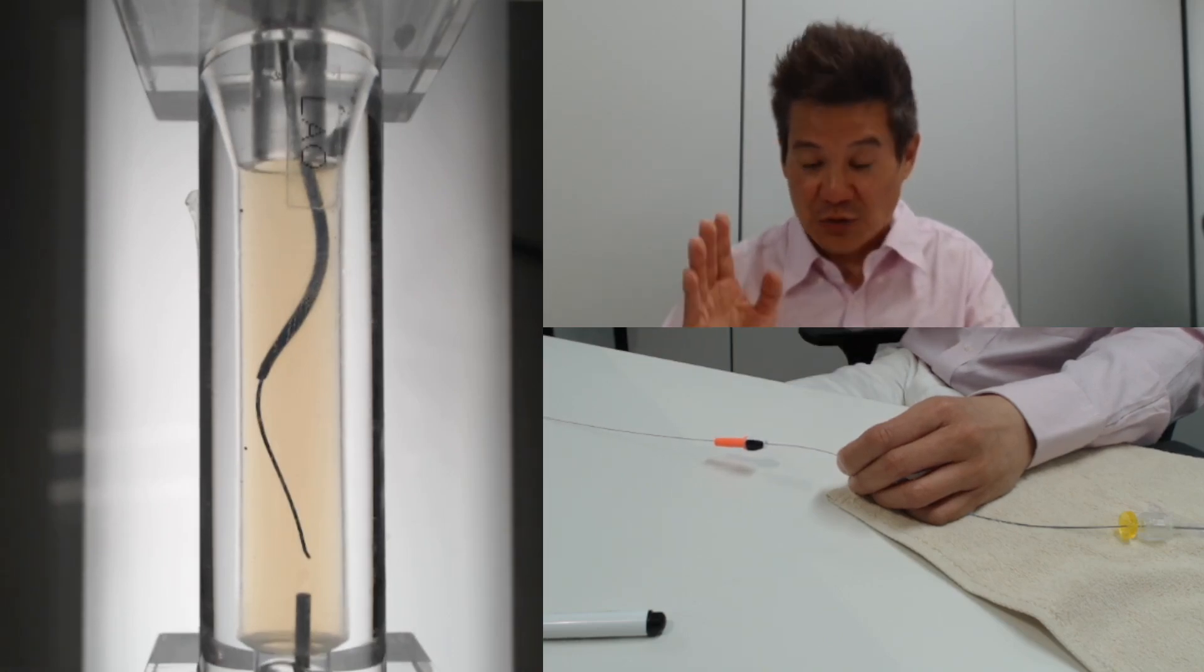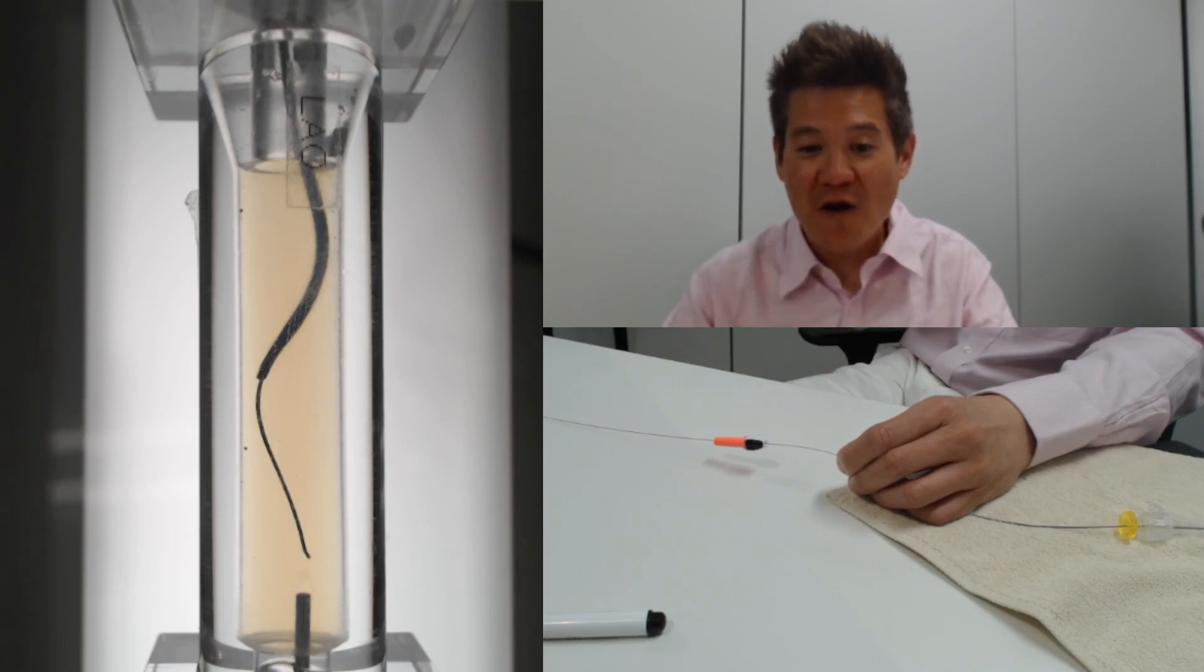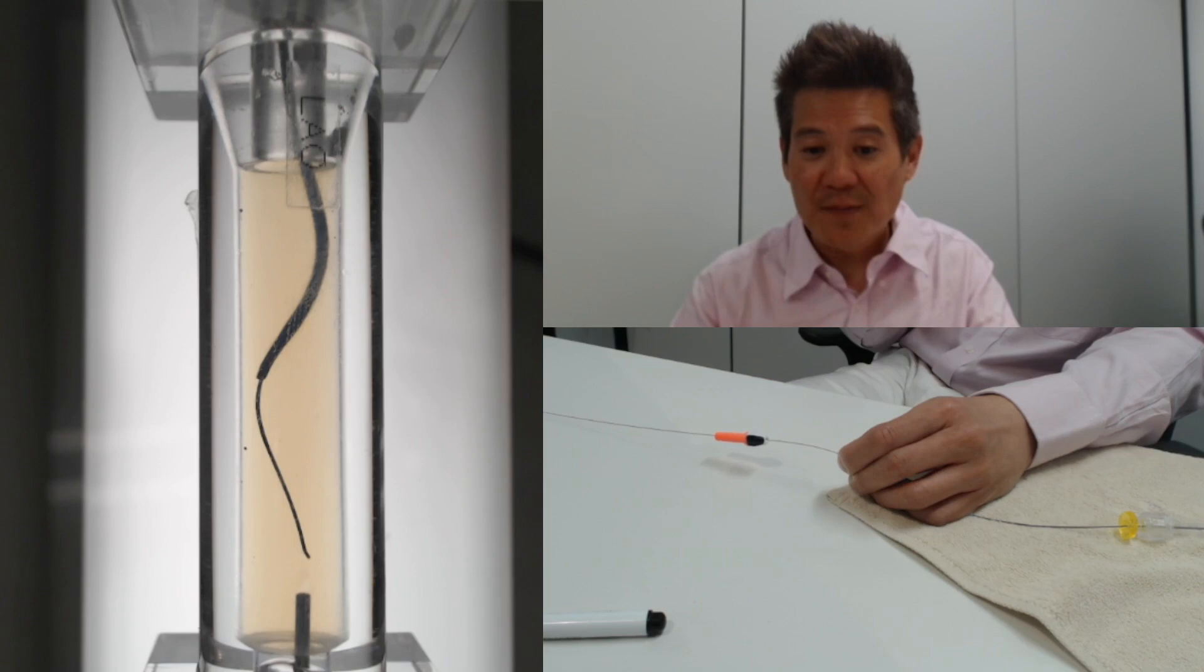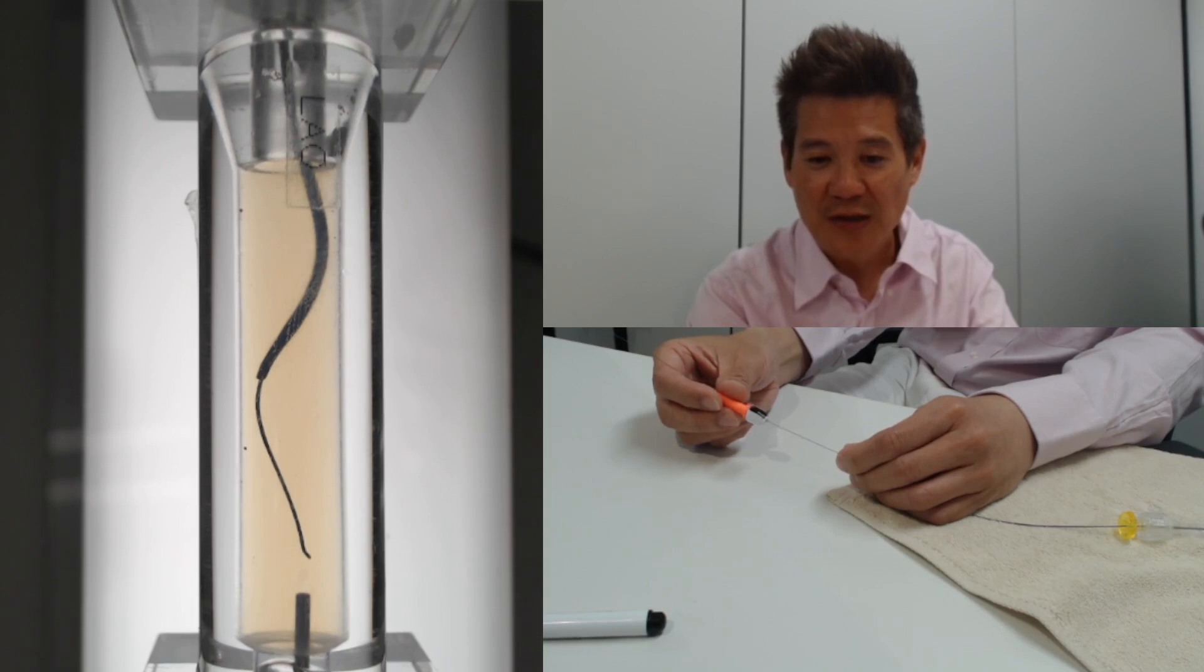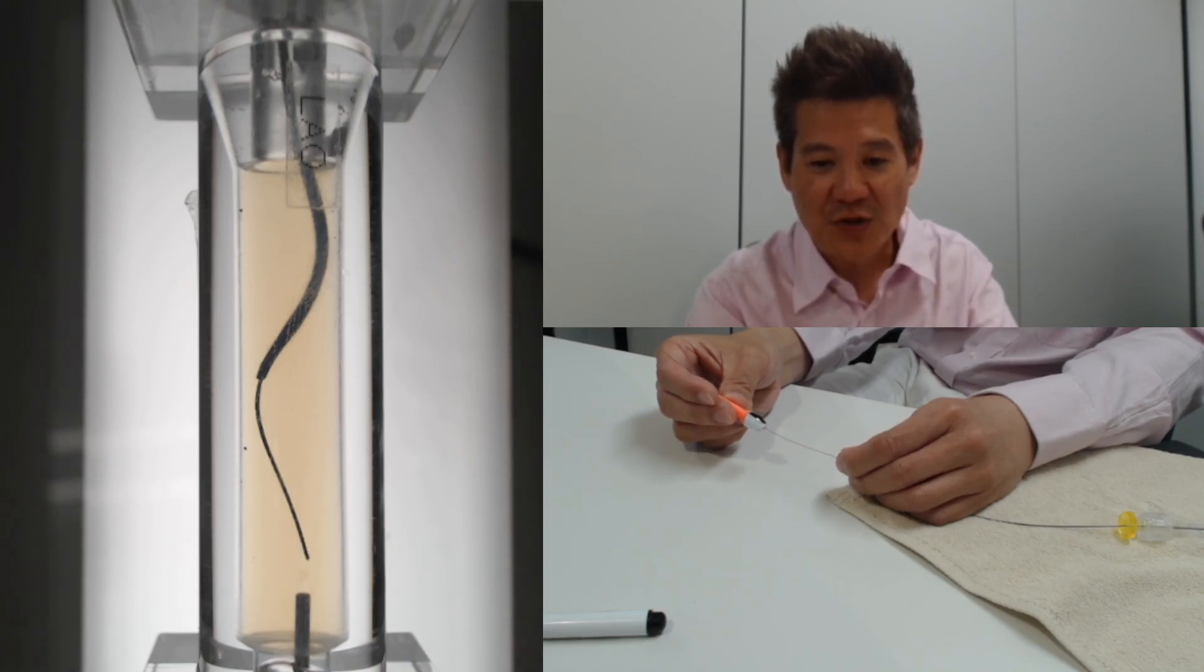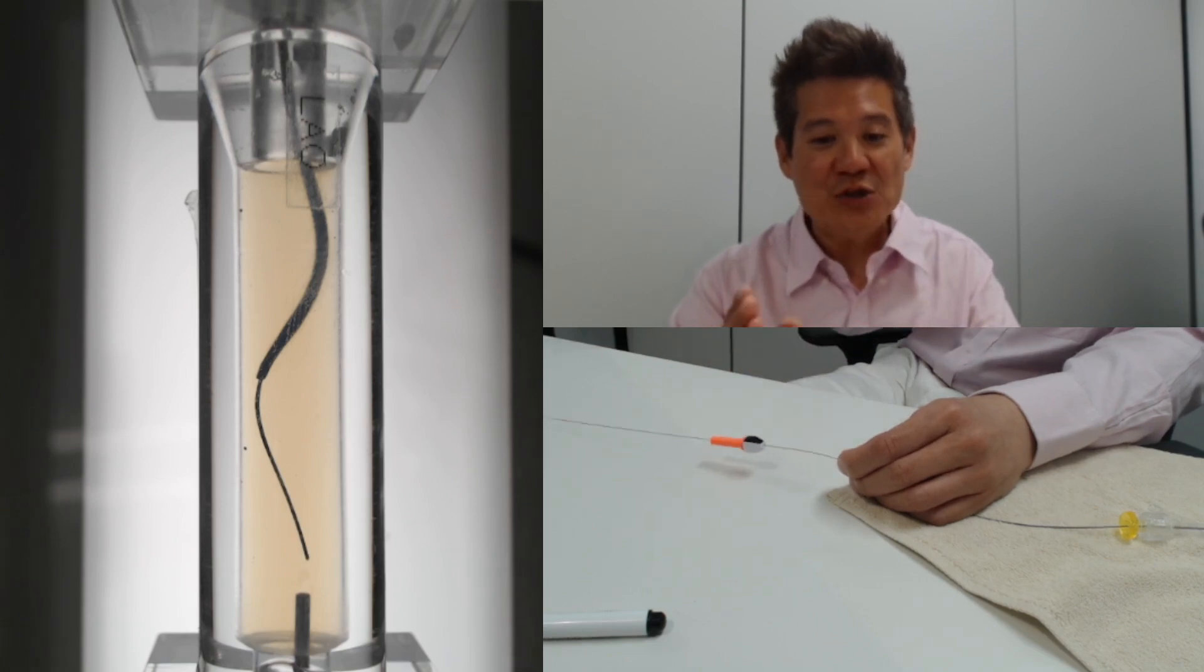Here what we want to see is two pieces of information: how far are we from the cap, and we have almost slap bang in the middle here. It's about a third of the vessel, slap bang in the middle. If we are near slap bang in the middle, what we need to do is just straighten the tip of the wire with very small rotations. The advantage of these very small rotations is that you'll know which direction will turn the wire tip towards the target.